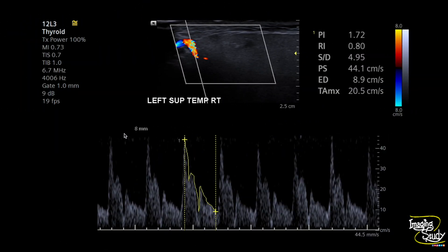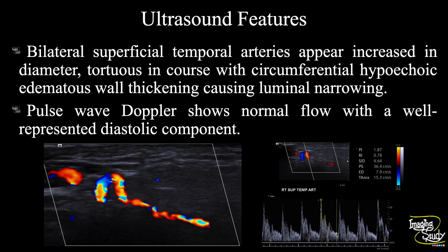The peak systolic velocity on the left side was around 44 cm per second with a good diastolic flow here also. In summary, bilateral superficial temporal arteries appear increased in diameter, tortuous in course, with circumferential hypoechoic edematous wall thickening causing luminal narrowing. Pulsed-wave Doppler shows normal flow with a well-represented diastolic component, suggesting a case of Giant Cell Arteritis.